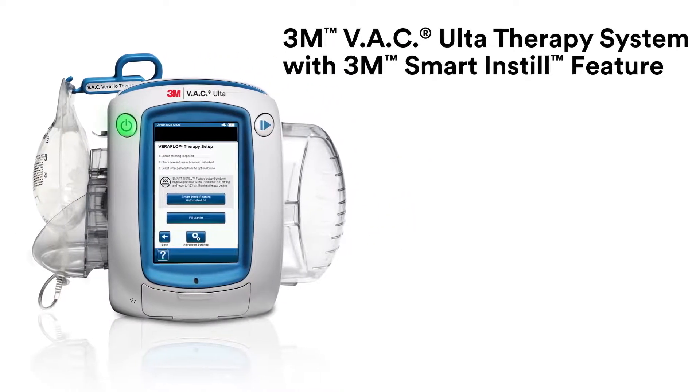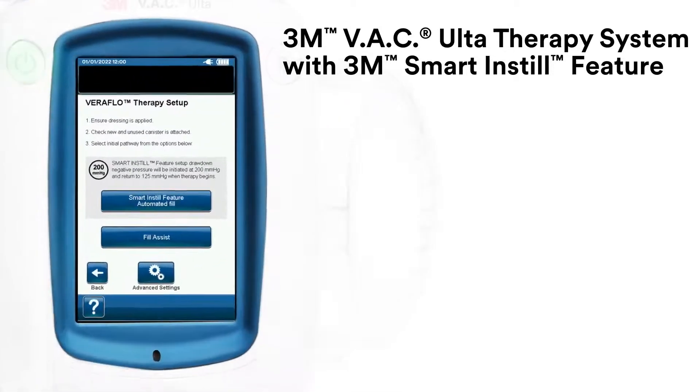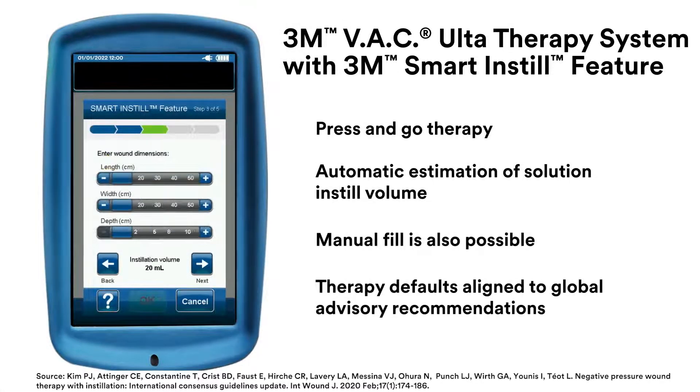As a result of this commitment to innovative wound care, the 3M VAC Alter Therapy System offers the 3M Smart Instill feature, which simplifies therapy initiation. Its automated estimation of instillation fluid and animated help assistance allow you to apply VeriFlow therapy confidently.